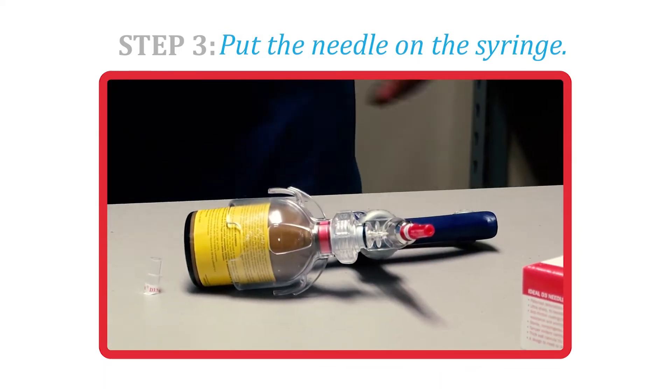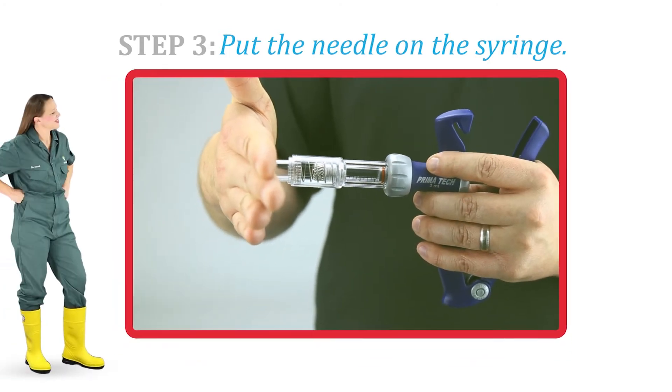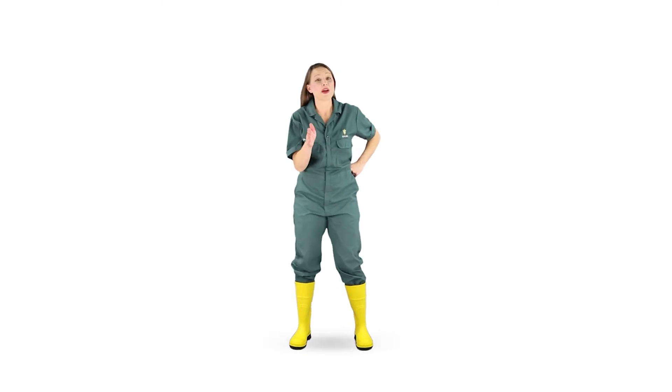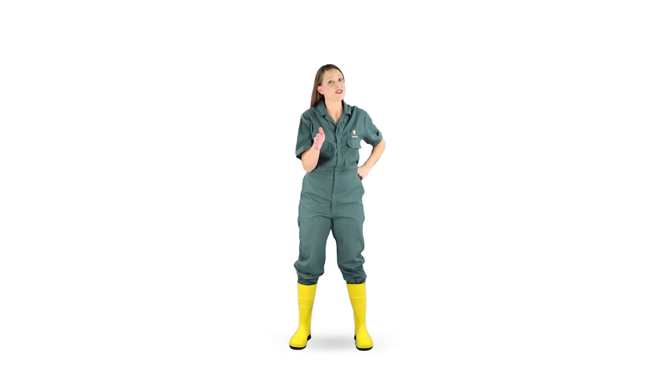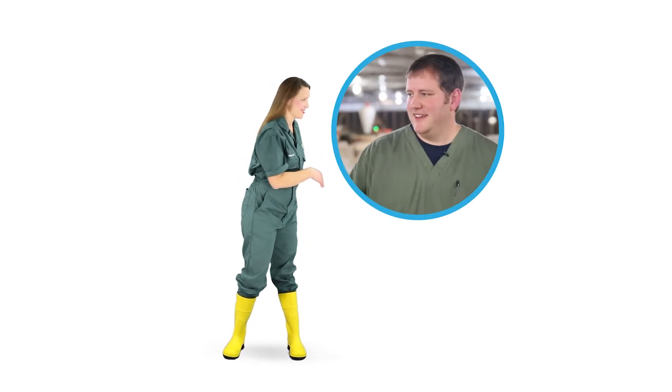On this syringe, we're also going to attach the safety to better protect me from injecting myself. Now, if you do inject yourself, contact your physician and bring the product sheet with you to the doctor.